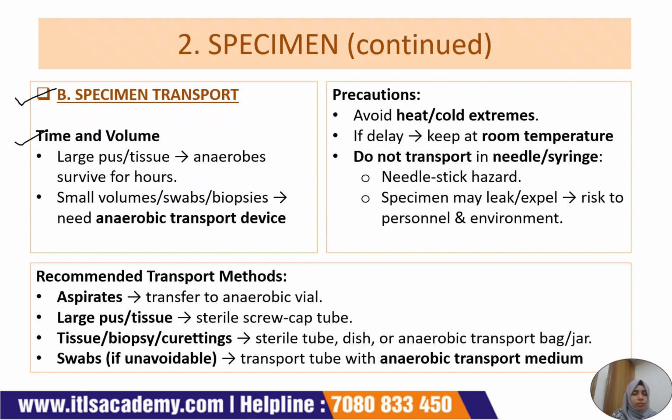Large volumes of purulent material and large pieces of tissue maintain the viability of the anaerobes for many hours. The second point is that small volumes, and swabs or biopsy materials, are generally considered to be transported via an anaerobic transport device. What are the precautions we must take?